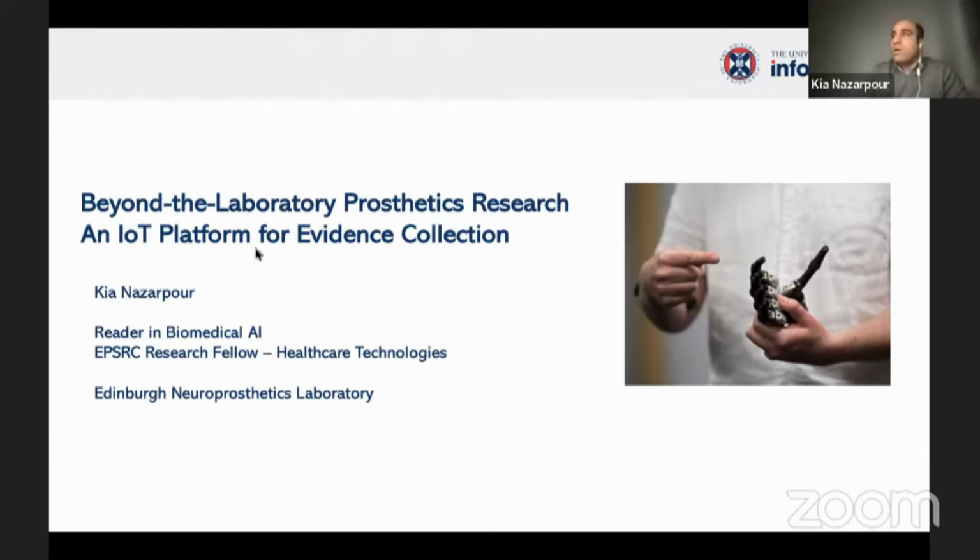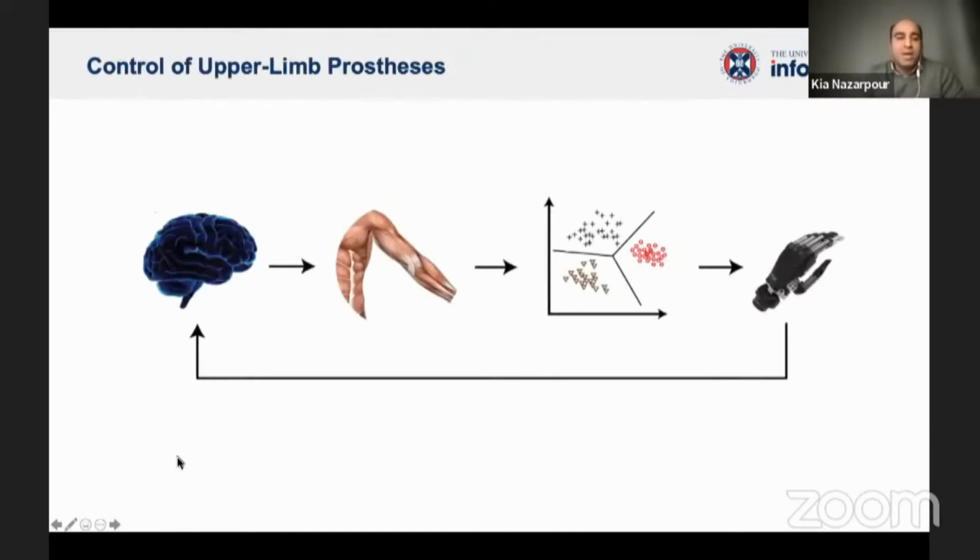Okay, so I want to focus on the topic of beyond-the-laboratory prosthetics research, and I'll talk about an Internet of Things platform that enables collection of evidence. I've been told that there are a lot of people in the audience who might not know how myoelectric prostheses are controlled, so here is a very simple diagram.